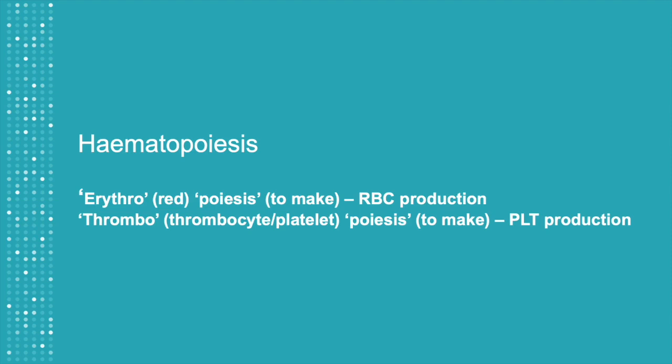As the title indicated, we're going to be focusing on red cells and platelets in this particular webinar. White blood cells will be covered in an additional webinar a little later. So let's start our journey and talk about the beginning of time, the red cell production, erythropoiesis, and the platelet production, thrombopoiesis.